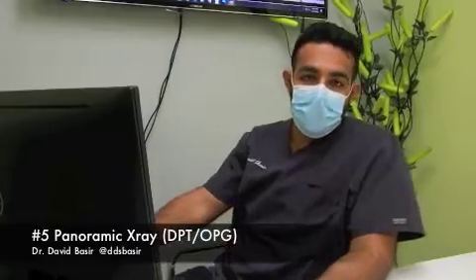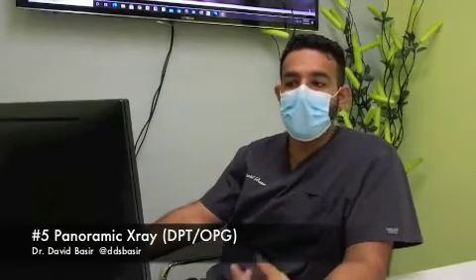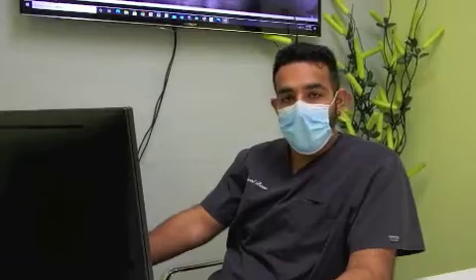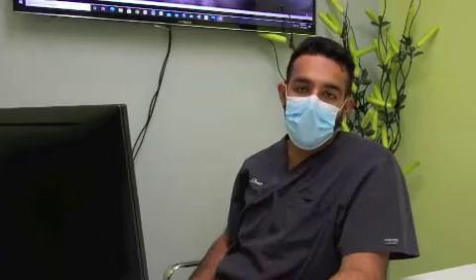Hi, good morning everyone. I'm Dr. Basir. I'm working here at Gentle Dentistry, and I'm here to explain how we use the panoramic x-ray to help with diagnosis and treatment planning. The panoramic x-ray is a broad x-ray taken of the lower face, so we're able to visualize the lower and upper jaw and the associated structures within it.